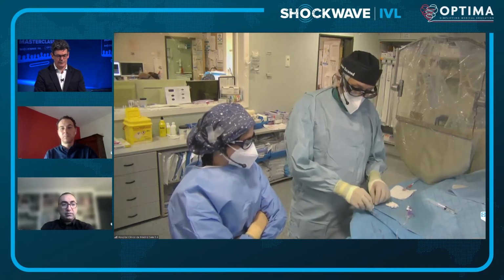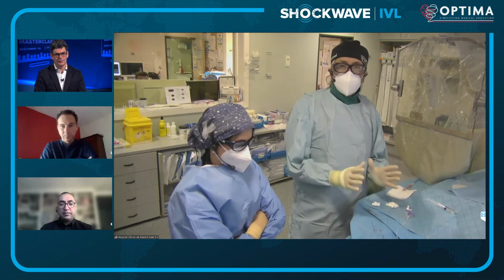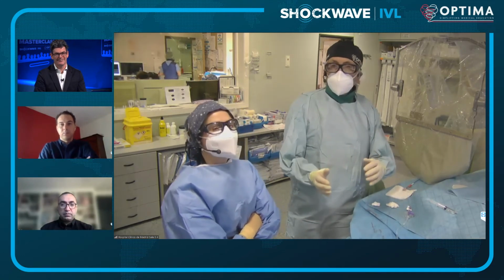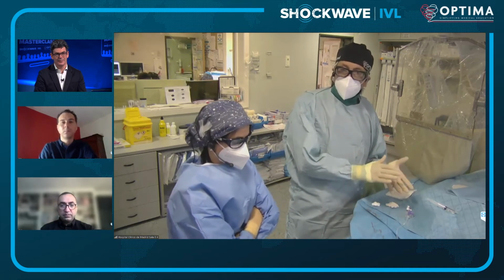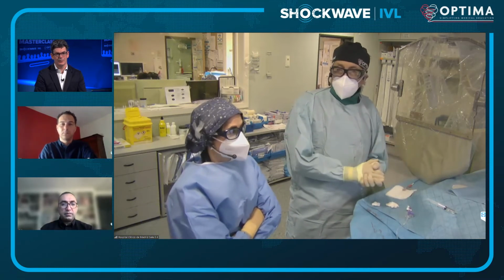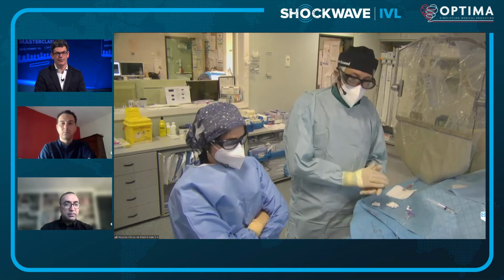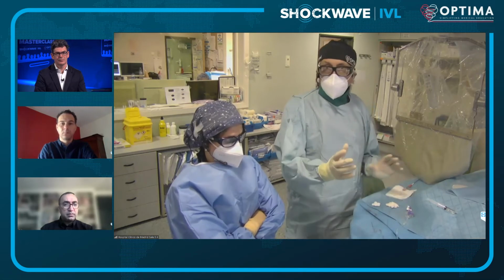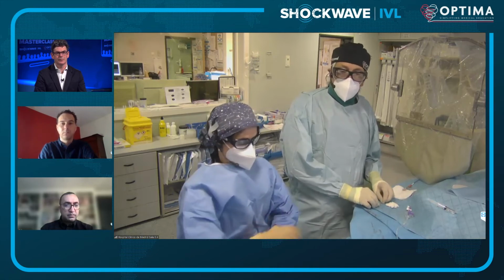But I also fully agree with you, Jonathan, in the sense that we have to be ready to deliver a lot of energy here. You have to be patient. You really have to be patient. And sometimes move your shockwave balloon, not always perform the hits of energy at a particular point. We've seen that sometimes it is more important to start changing the characteristics of the shoulder of the calcific plaque, being able to then subsequently modify this. And monitor the progress that you are making, sometimes using rotational angiography to see if your balloon is making progress in expanding, in concentric lesions.